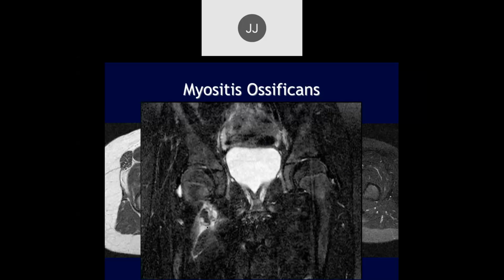So excision is not something that is recommended. This is not the usual location of these. I'm sure you know that, but usually it's a quadriceps. But these, you operate and you may have more problems than before surgery. Thank you, John.